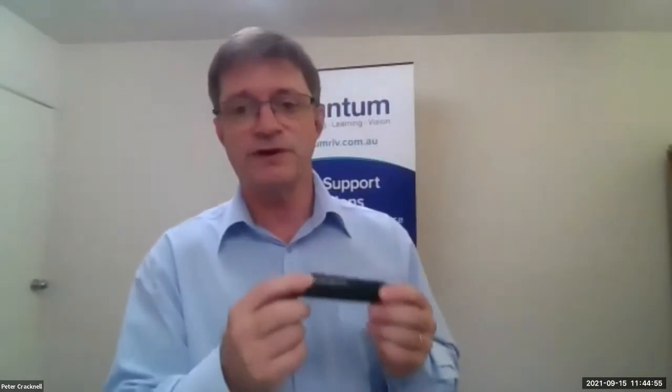I'm going to give a demonstration of the OrCam Read. Rebecca mentioned there were two versions of this device — one which is worn on spectacles. It just fits, and it doesn't have to be prescription spectacles; it can be blanks like this. And that, of course, enables hands-free use.